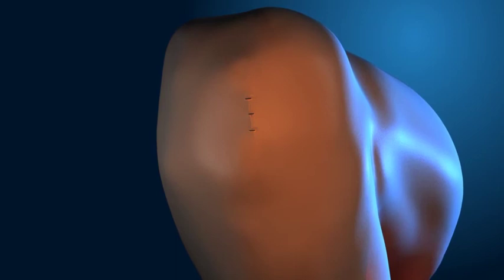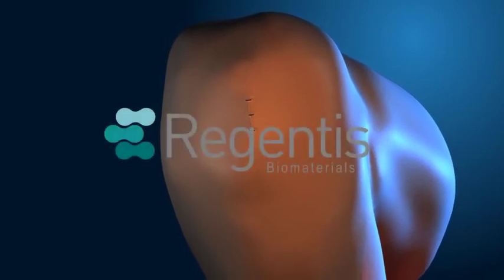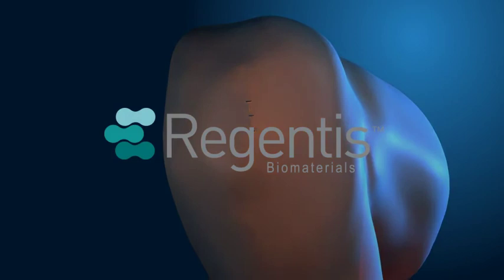Finally, the joint capsule is closed using standard surgical techniques. Gelrin-C, synchronized with nature.